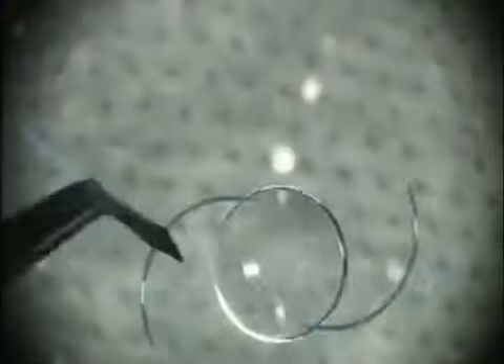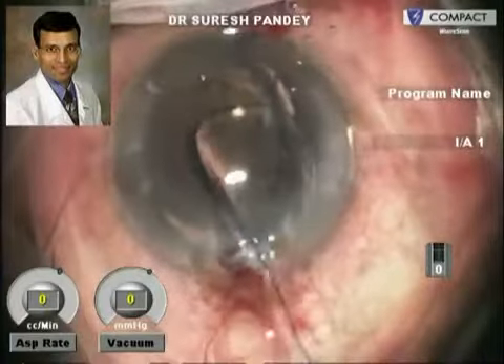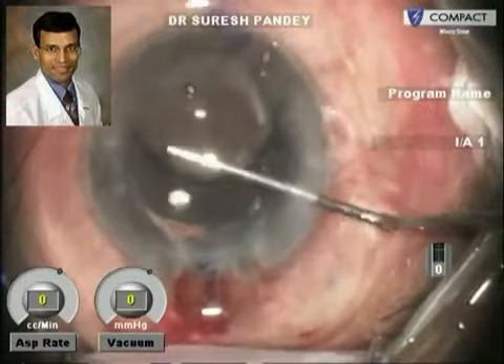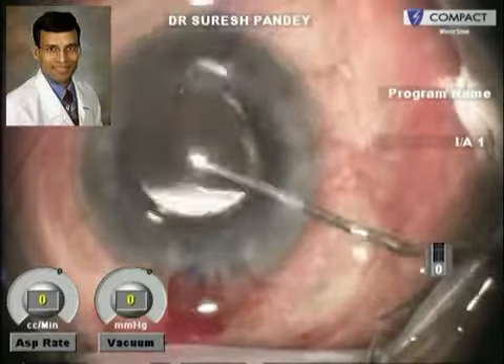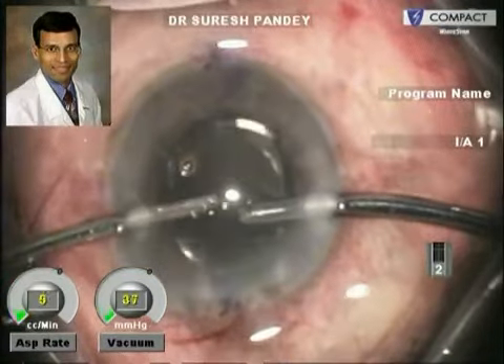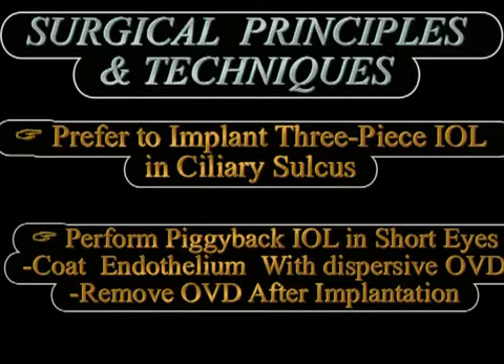Coming to the surgical technique, it is generally preferred to implant a 3-piece IOL in the ciliary sulcus and we should never implant a square-edge IOL, to minimize the chances of iris chafing. In cases of high hyperopia with short eyes when doing primary piggyback IOL implantation, we must always protect the corneal endothelium because these eyes have relatively shallow anterior chambers, and coating the endothelium with a dispersive viscoelastic is extremely useful.